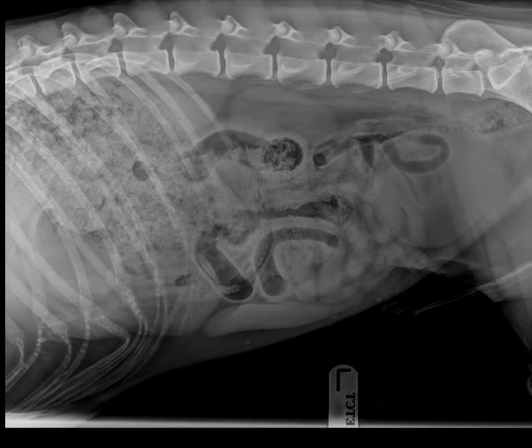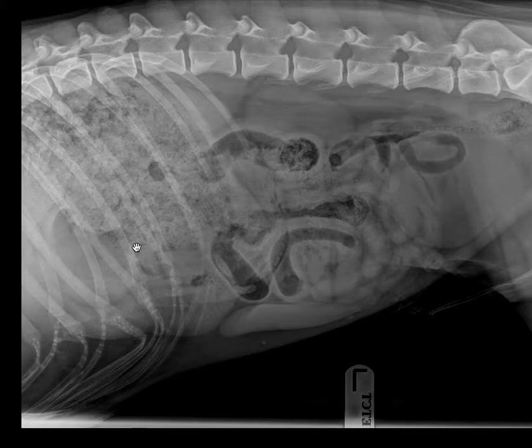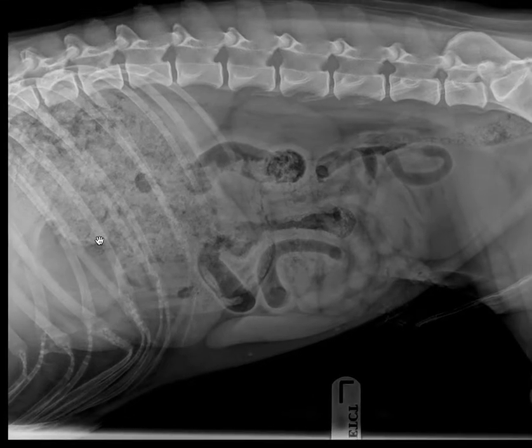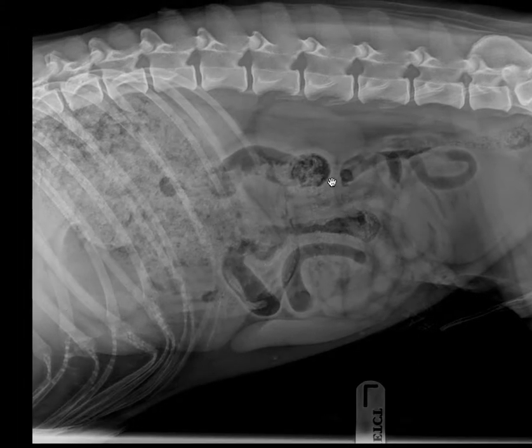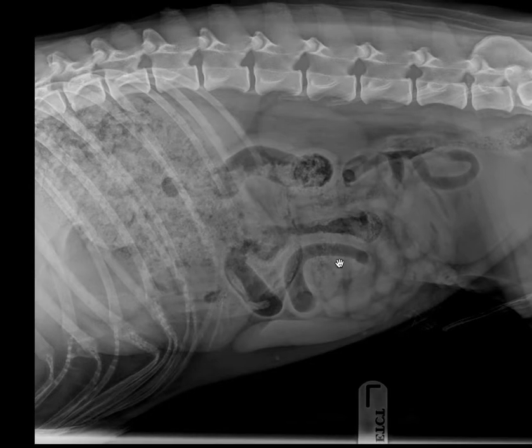I like to use all the views. Here we're on the left lateral. The left lateral view is preferred in vomiting patients, especially if you're not trying to rule out gastric dilation volvulus, because on the left lateral view the pylorus typically will contain gas. In this dog, the pylorus is here. You can see there's a soft tissue or fluid opacity and some gas opacity in the pylorus. It's quite difficult to trace the duodenum in this patient. Often on this view we can trace the duodenum; however, there's superimposition of some structure, which is colon. I have a similar struggle — I can trace some of this as colon, but there's quite a bit more intestine containing granular ingesta than I would suspect for simply colon.